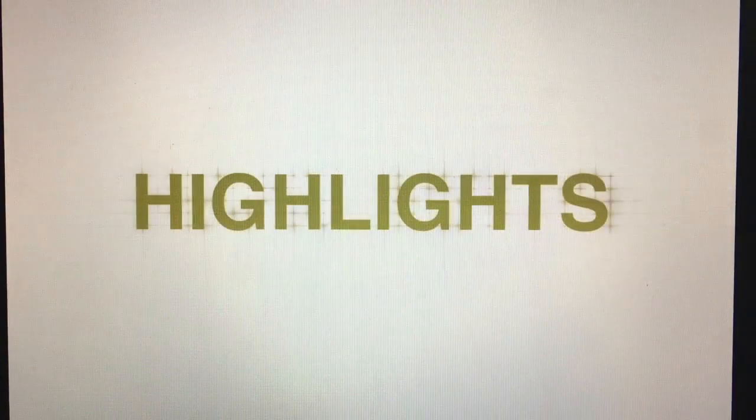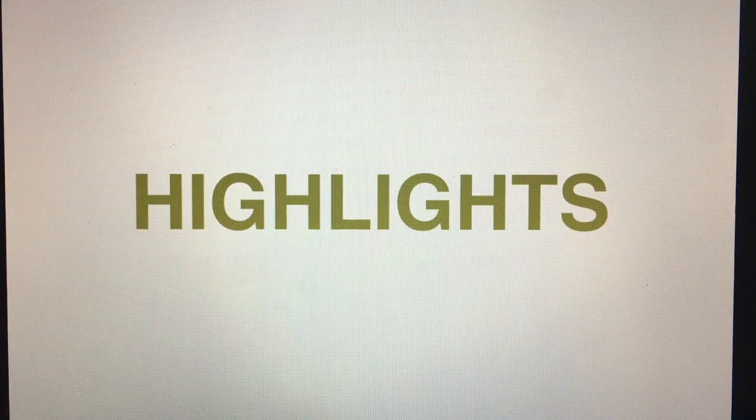Now I'm just going to review some of the highlights of the video and the key points. Again, the entire video is just to be used as a reference and hopefully a guide.